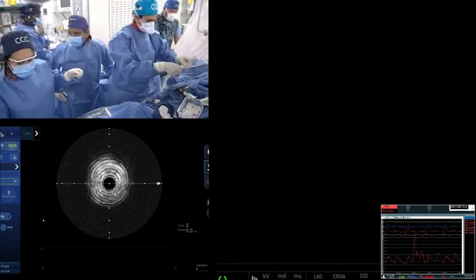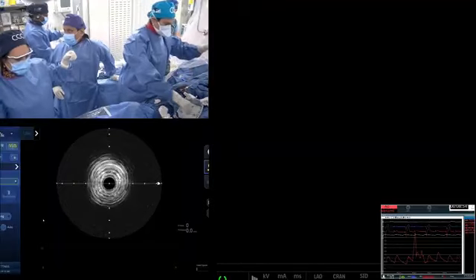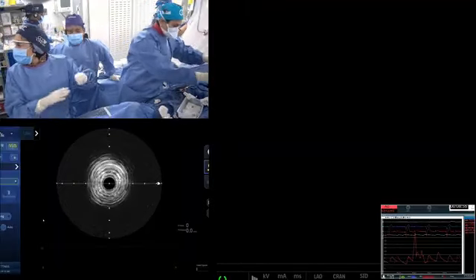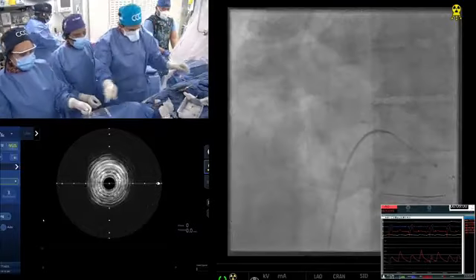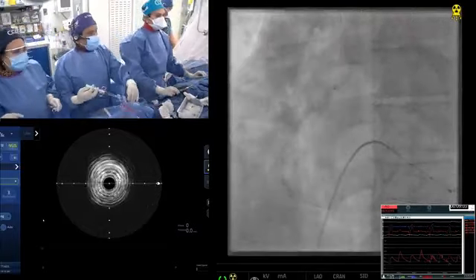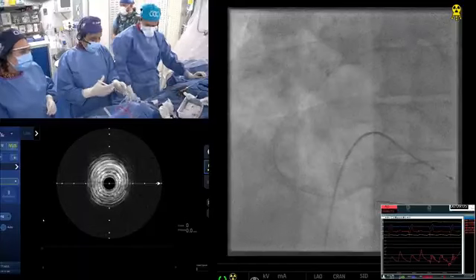But Dr. Sharma, angio always helps the IVUS interpretation. I can focus on where the lesion is. Okay, let's take the picture then. He said, do the angiogram first. Okay. All right. Kiski says, angio first.